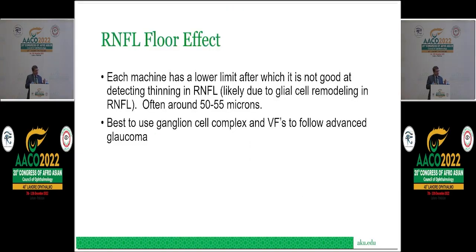The other thing when you're doing the RNFL, the circumpapillary scan, is the floor effect. Joel Schuman, one of the inventors of OCT, the technology developed by the Massachusetts Institute of Technology, MIT, with Carmen Puliafito and Joel Schuman. Those guys were also at Harvard and Tufts and worked with MIT.